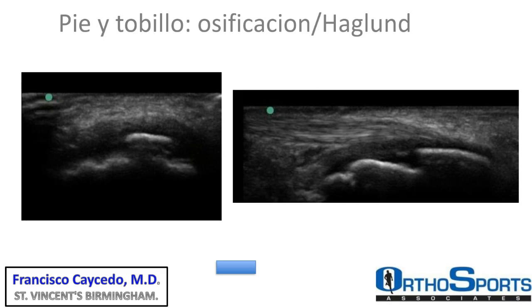So again, this is a very nice image that can be used by surgeons in ultrasound-assisted surgeries, where we can be more selective and treat this pathology. And it's crucial for athletes in high elite competition, our soccer players, where they don't have the opportunity to be down for 6 months or 8 months. So being selective, hopefully we can help them. Of course, this is just the beginning. We don't know the final outcome, but I think this is a very promising technology to help our patients and the sport community.